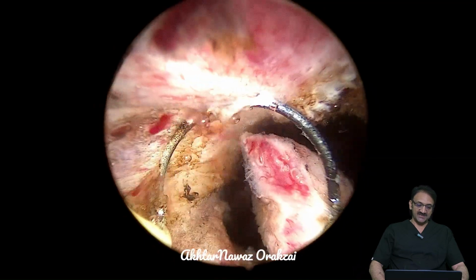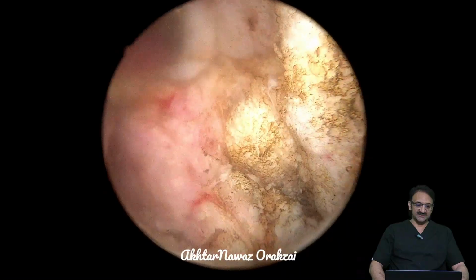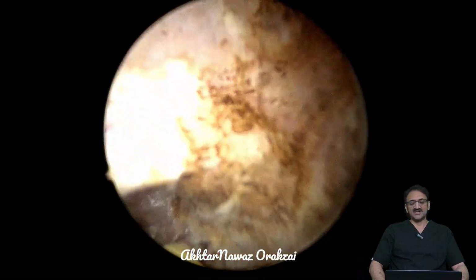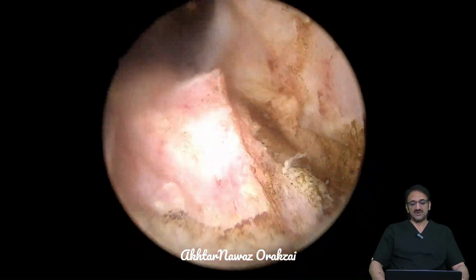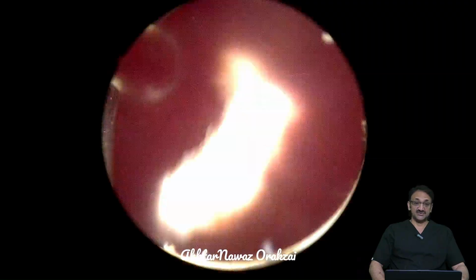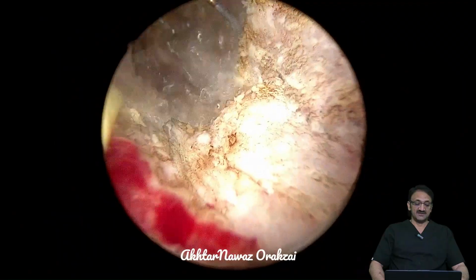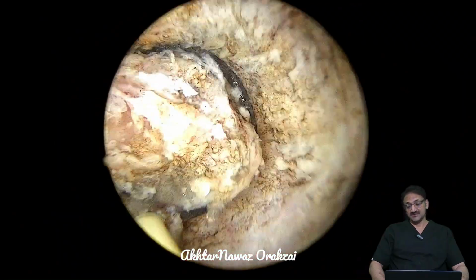So the indication in him was this median lobe with recurrent urinary tract infections, as well as recurrent episodes of retention. But we also thought that, as you saw, there were a lot of uric acid stones in the bladder. There were some incrustations within 4 weeks on the DJ stent as well.